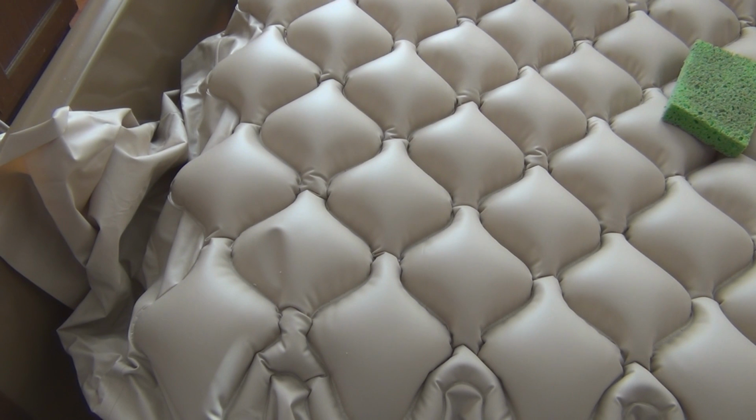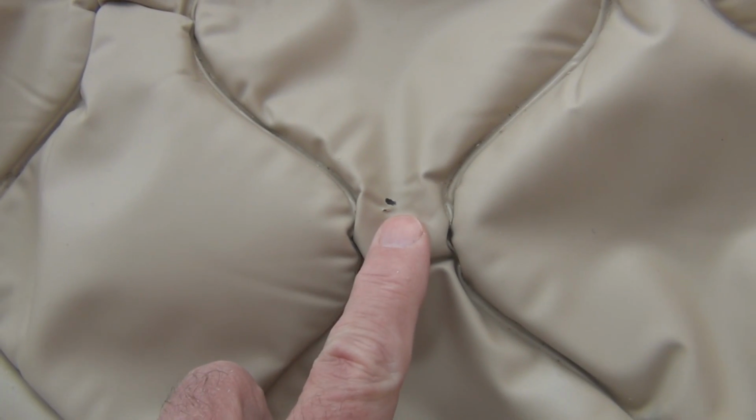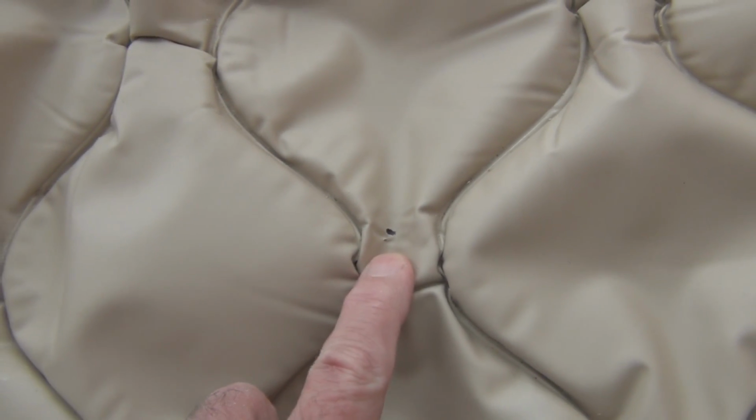Maybe I'll put a mark on the leak there so I know where to patch it after I take this off. So I just put a little mark there because I didn't want to put too much ink. I don't know if that would interfere with the patch kit. So just a little black mark there to help me find that later on.